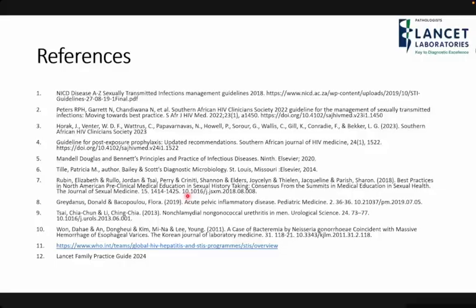Cultures, we do cultures and we do see Neisseria gonorrhea. The problem is, when these cultures are done, they are left in the ward, they're not brought to the lab as soon as possible. That's the problem we see from the laboratory, because diagnostic stewardship is very important. We always say it's rubbish in, rubbish out. If you give us a sample that was there for such a long time, and Neisseria gonorrhea is very fastidious, we're not going to grow anything. And that's what we are seeing.